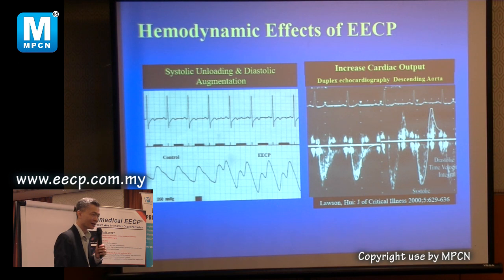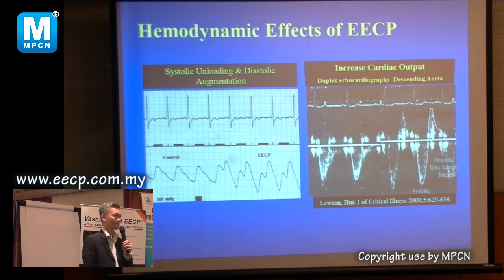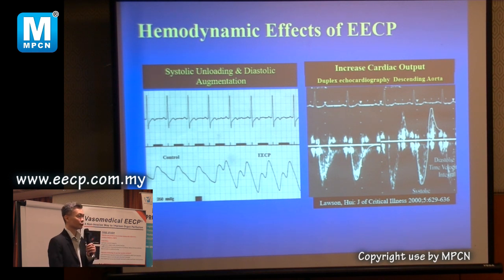Mr. Zaidi: What level of blockage do you think can be helped by using this therapy? Those people with a serious block, either 1, 2, or 3 blocks, and still cannot be operated on or refuse operation, this will help them. Is there medical data to show a positive result? Positive results in terms of reducing symptoms and also preventing death, yes. But short term, you have to repeat it every 1 year, 2 years.